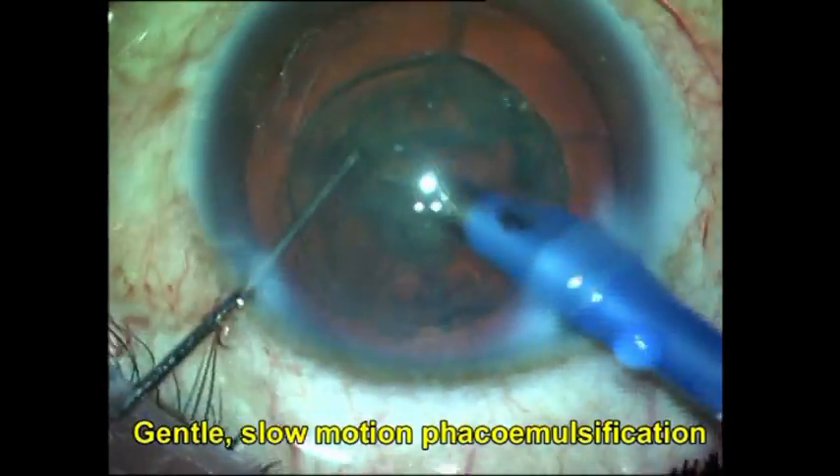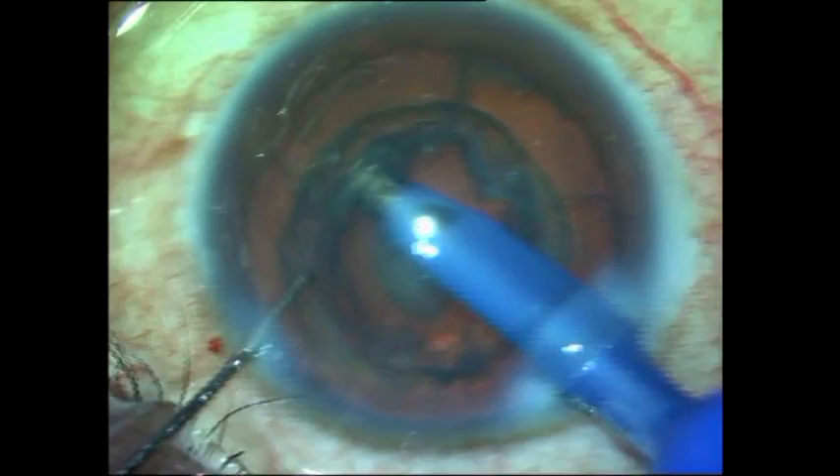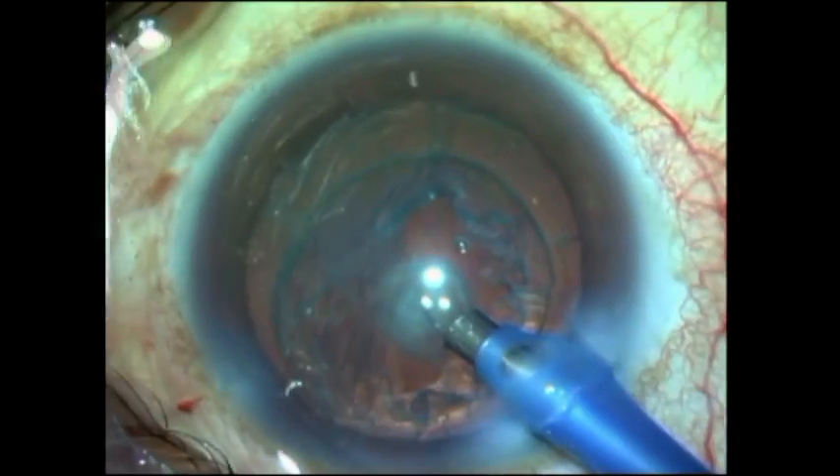Once you've done this, the other important thing to notice is to avoid chamber fluctuations, and therefore before withdrawing the phaco probe you always inject viscoelastic.